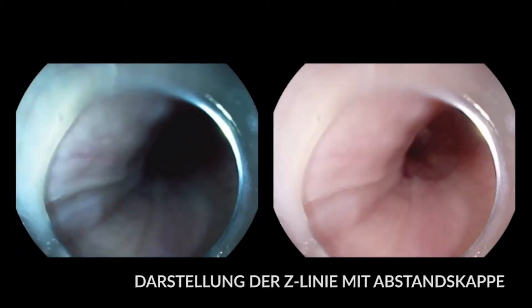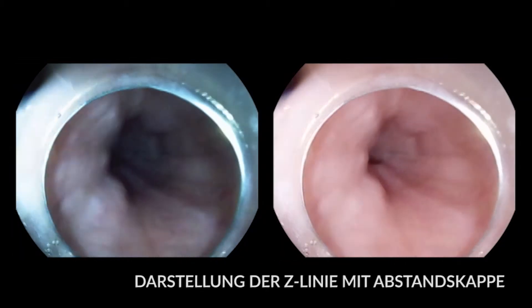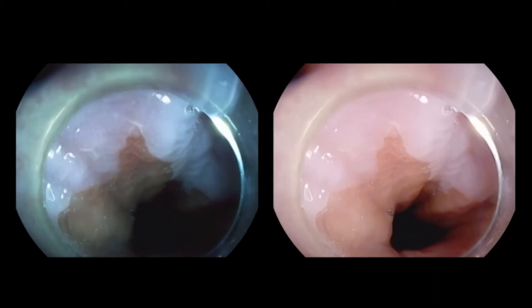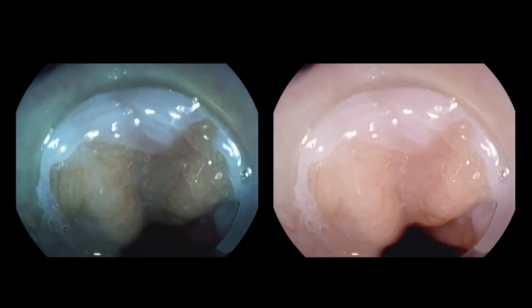Using a distancing cap, the mucosa is spread apart to allow better visualization of the mucosal details in individual areas along the circumference.